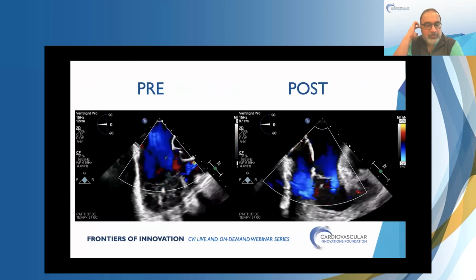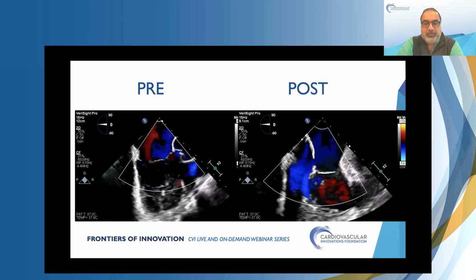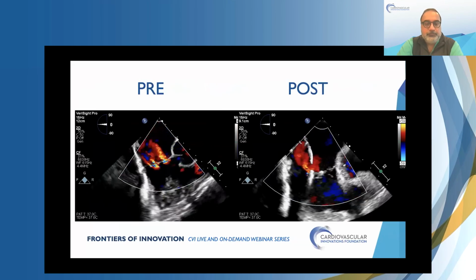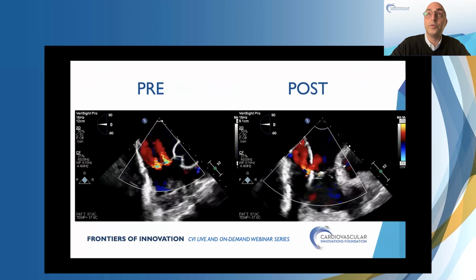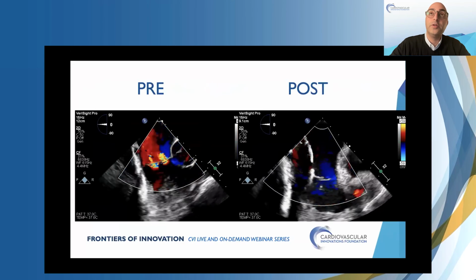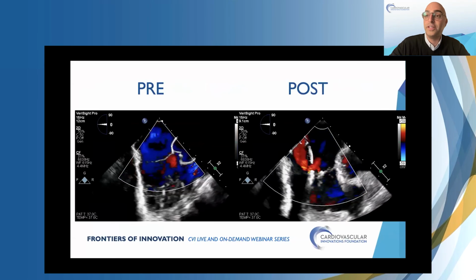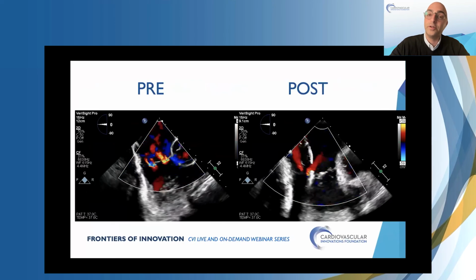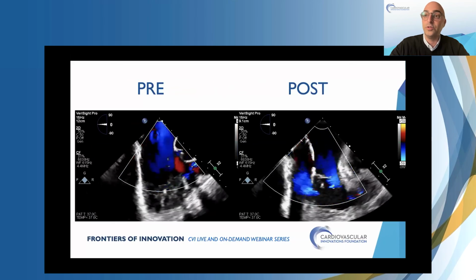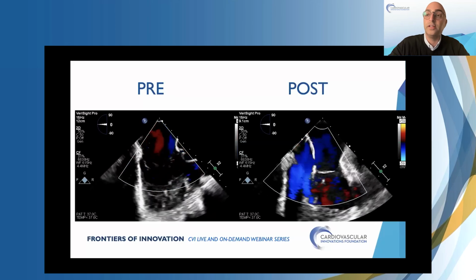And I think that's where the concept described by Nadira and Lynne and you, Edris, has really resonated with myself in terms of using it methodically. I'll be honest, Gagan, I use this when we're doing a pre-tricuspid TEER case. You'll ask me, and I'll tell you, hey, there's a grasp view for this mid-SA. And you'll say, how do you know? I'm like, well, I use 3D navigation when I was in mid-esophageal. And I know that if I go to 162, that'll probably be our grasp view. And I can get that because then I'll show you. So you can actually use this technique for other things, which has been very helpful for teaching fellows.